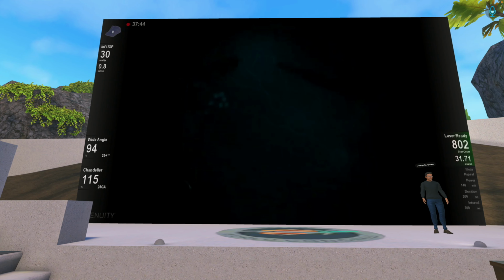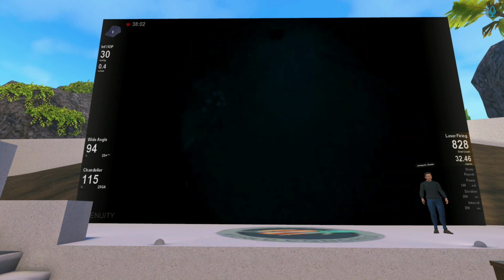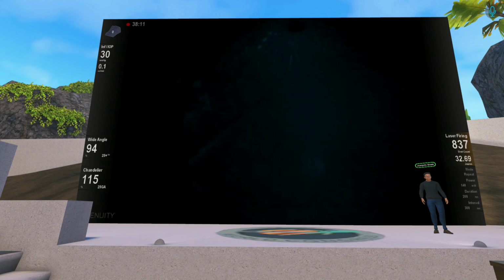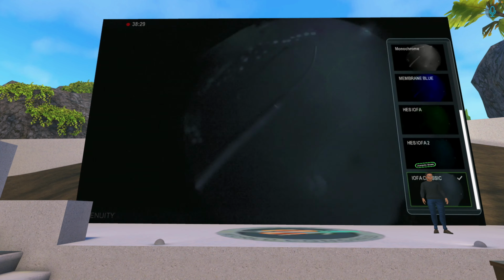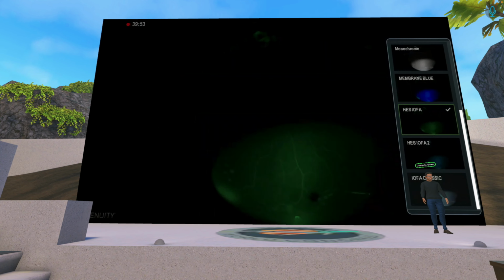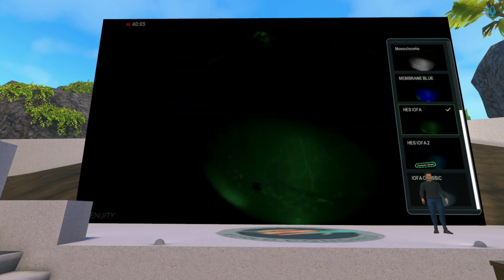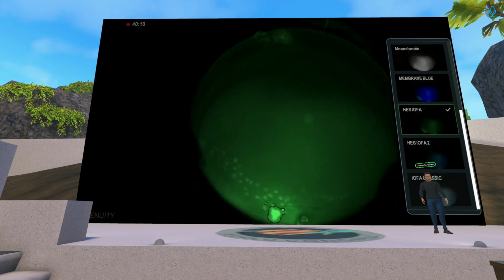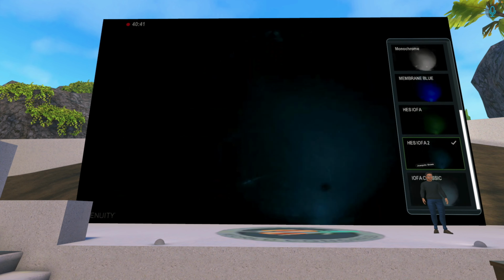Did you come up with the gray settings, or is that something already on Ingenuity? No. I can tell you. I like this one because it allows you to see leakage better, and in the videos, it's better for presentation. I believe, I don't remember exactly, but the cyan was 0, magenta 100, and the yellow like 50.